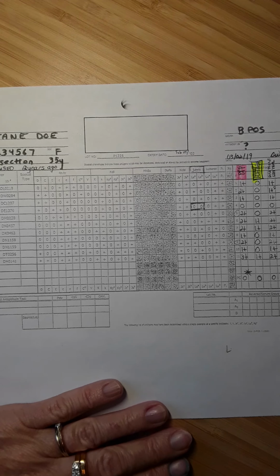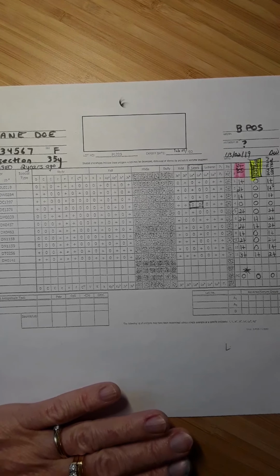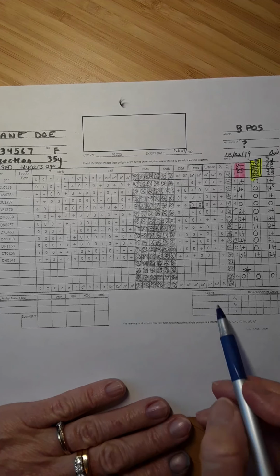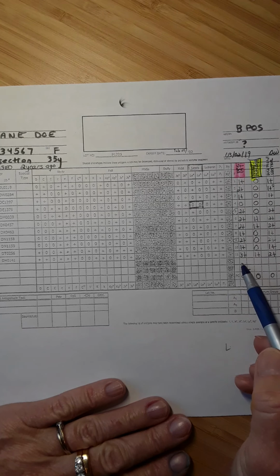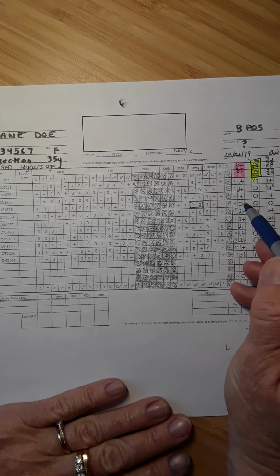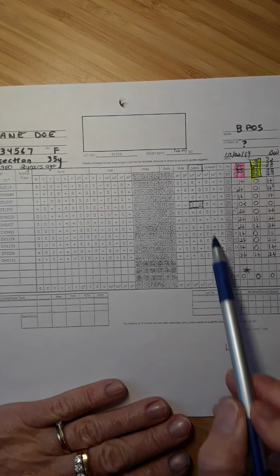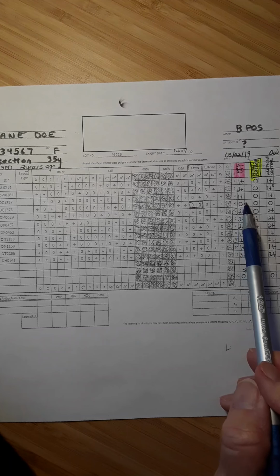So my thought immediately, but it might not be your thought immediately because you're all new to this, would be that, oh my gosh, I bet you this lady's produced some Lewis antibodies. Now, the biggest clue in this set of reactions is this negative reaction. Negative reactions often give us the best clue. And so if my hunch is correct that this person has produced some Lewis antibodies, this should make sense.